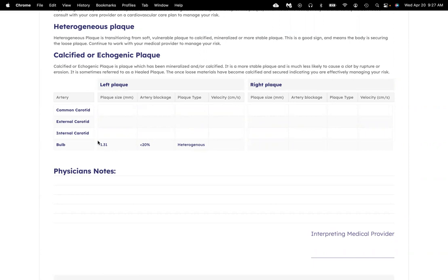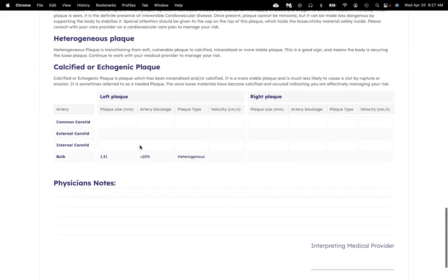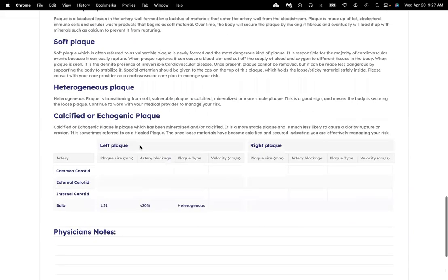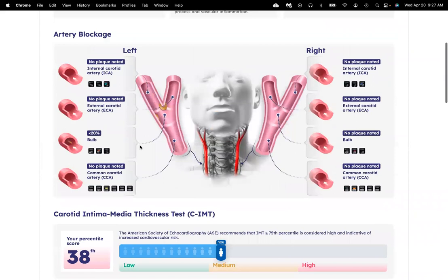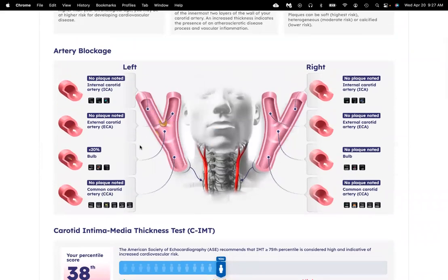In this case, you can see the plaque that's 1.31 in size. I hope you enjoy exploring your report and really learning about your cardiovascular risk.